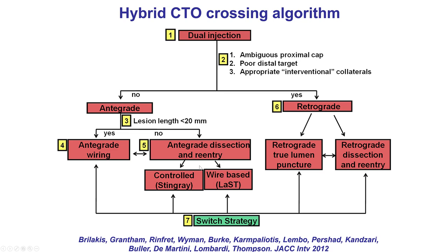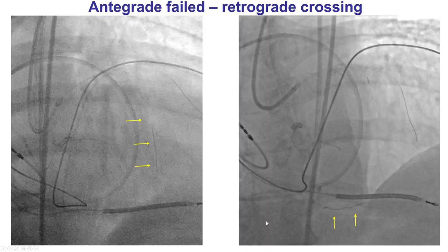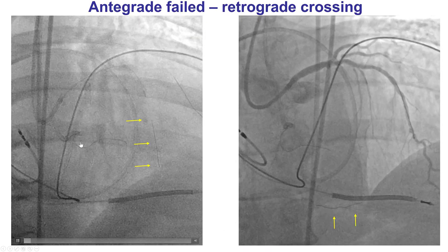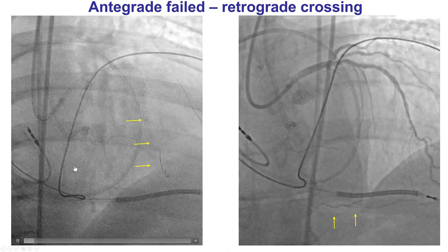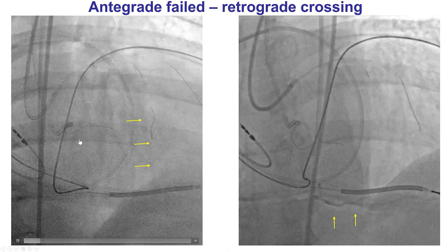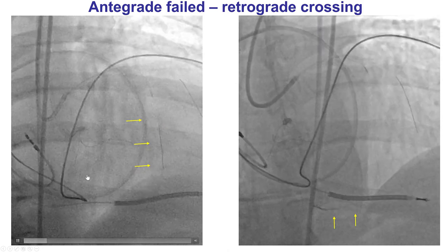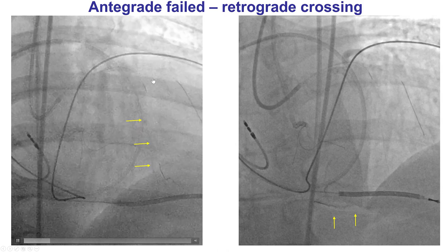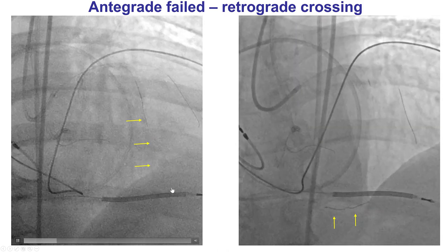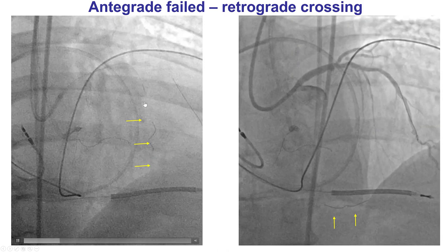We tried antegrade escalation for some time; however, this did not work. The wire made it to the mid-right coronary artery but could not go any further. As a result, we decided to change strategy, and septal collaterals were used for retrograde crossing.